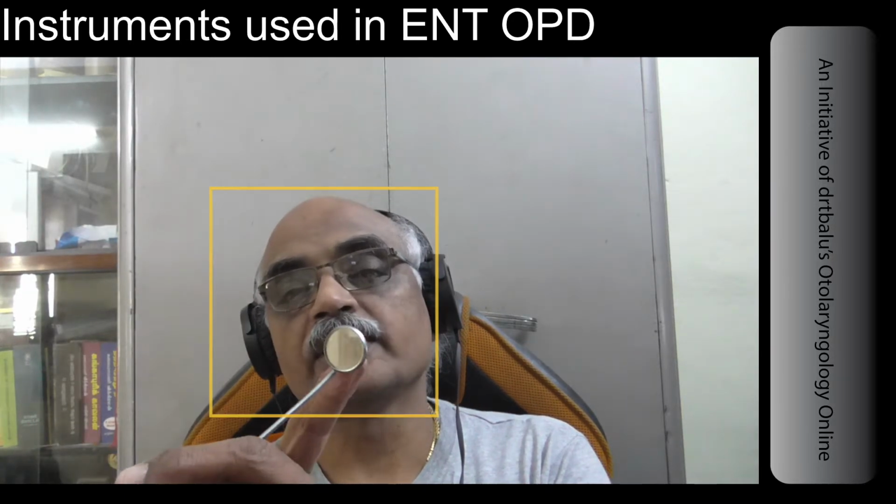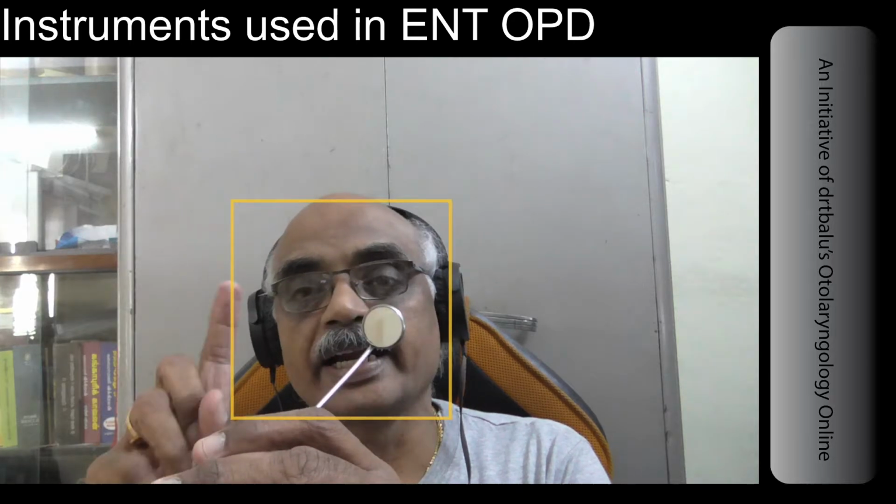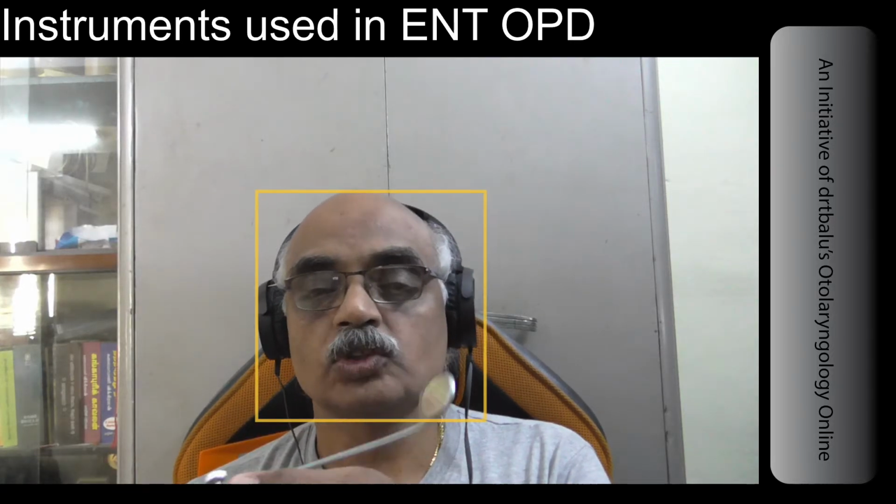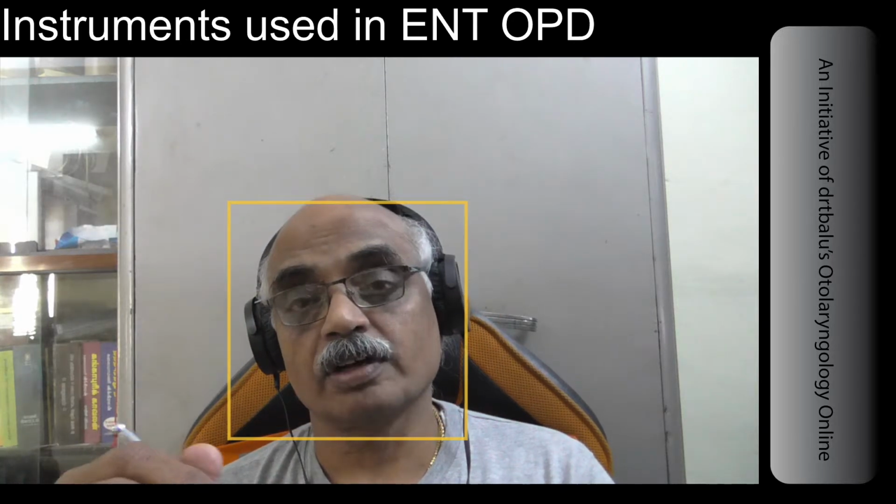If you are going to heat the metal side, I repeat because of the previous confusion, you should warm the mirror surface, not the metal surface. If you heat the metal surface, the metal will expand faster and the mirror will fall off into your lap. So always use a spirit lamp or warm water. If you are using warm water, the entire mirror as well as the metal portion will be warmed together, so there is no threat of the mirror falling down.